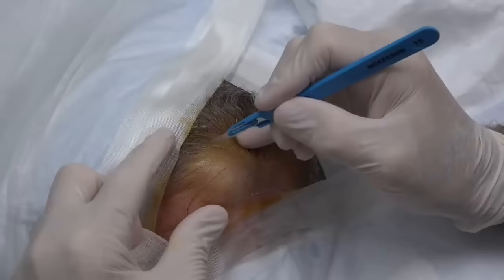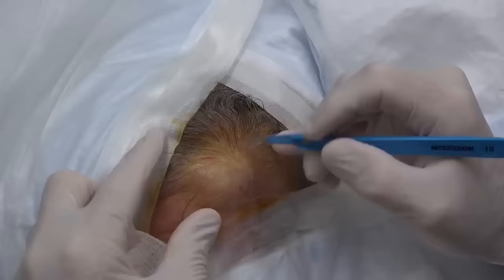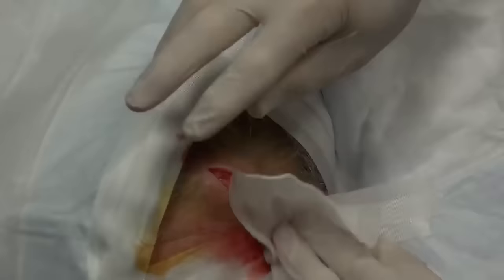Are you ready, Mr. Ralph? You did say it was okay if we videoed your procedure for all our friends on YouTube. They said it was just fine. So a little 15 blade so we can make a curve — we want to make a curve because we've got basically a convex surface that we're going to bring together.